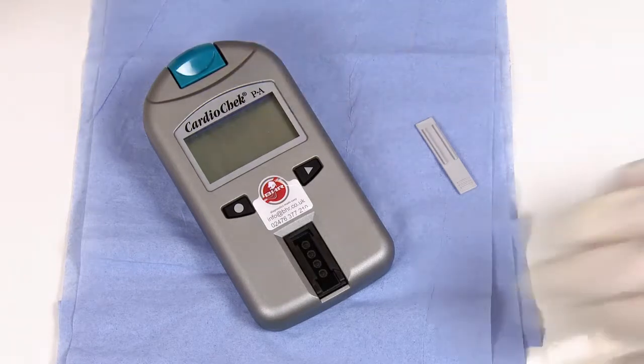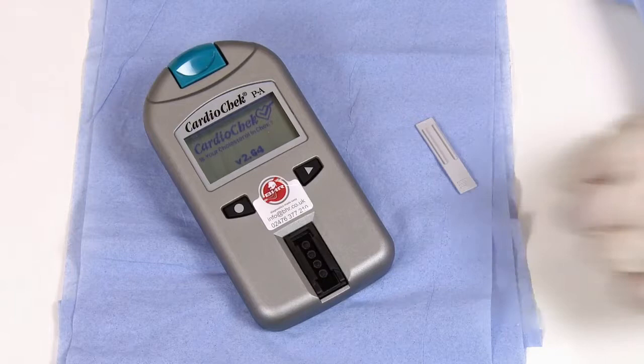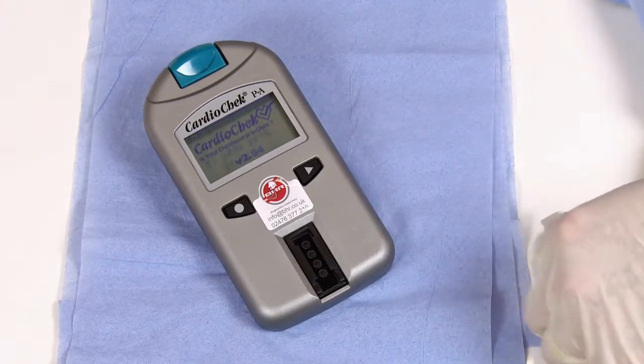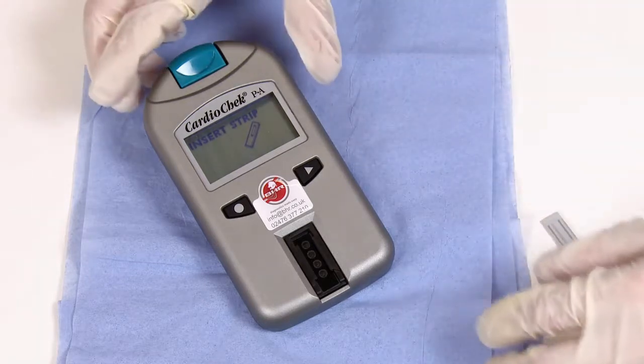To turn the analyzer on, press either button on the front. The analyzer will go through its startup procedure showing the software version along with the time and date. Once the analyzer reaches the insert strip display, press the circle button once to access the main menu.